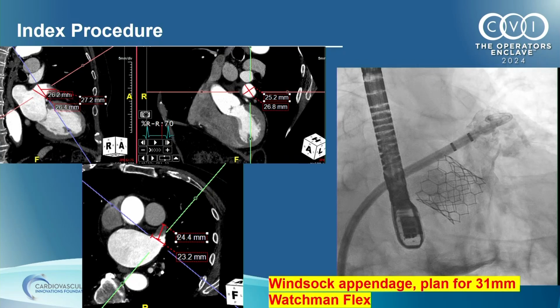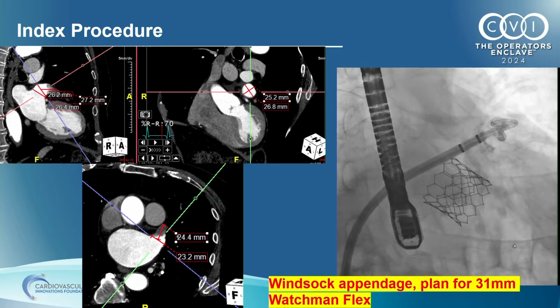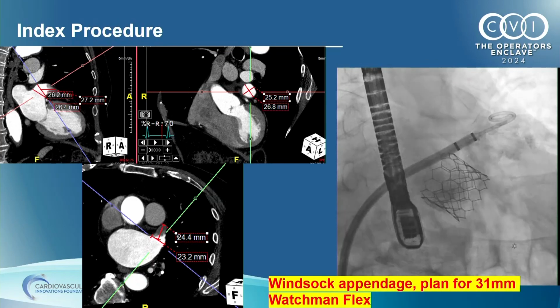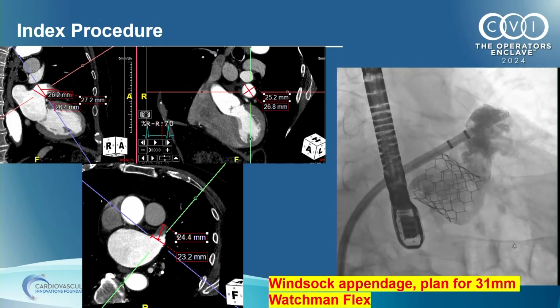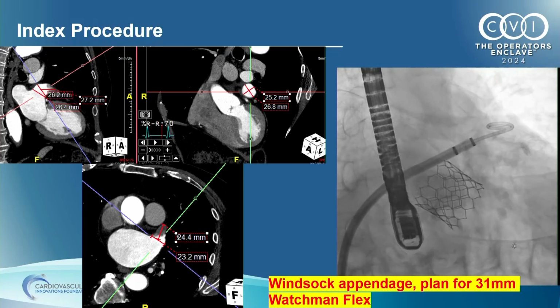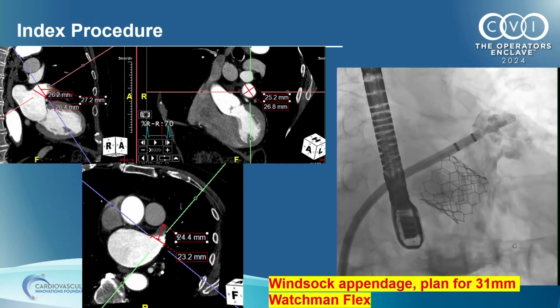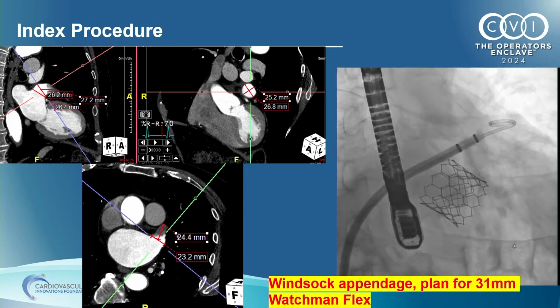If you see here, of course, it's hard to identify the depth of the anterior lobe in an RAO caudal, but the posterior lobe is also very deep, so I would probably have gone mid-posterior lobe up, and that 31 probably would have covered the proximal part, especially if you see the proximal part of the anterior lobe being very smooth without any pectinate muscles.